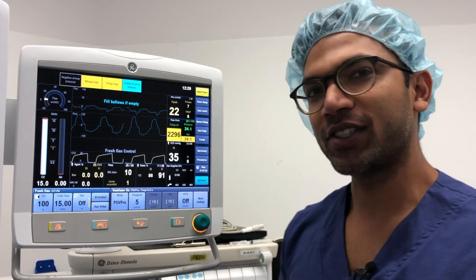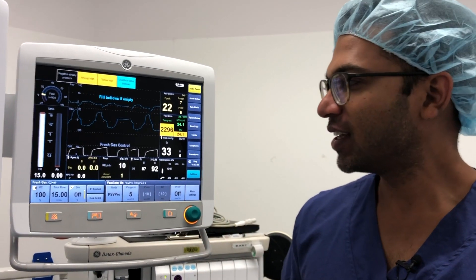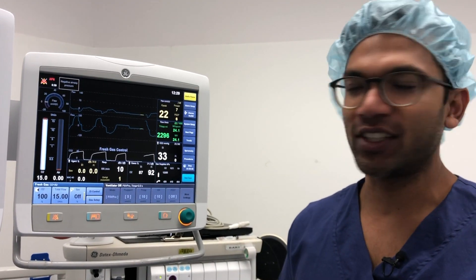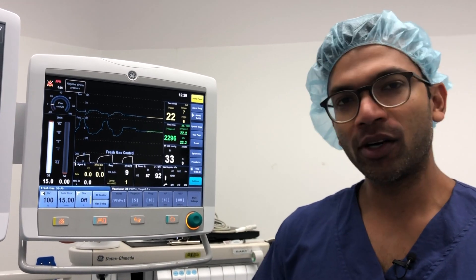I was able to get above 80% in maybe four to five breaths, and if you take even longer with some patients, you can get the end-tidal oxygen level to above 90%. So that was rapid pre-oxygenation with PSV Pro. Thanks very much.